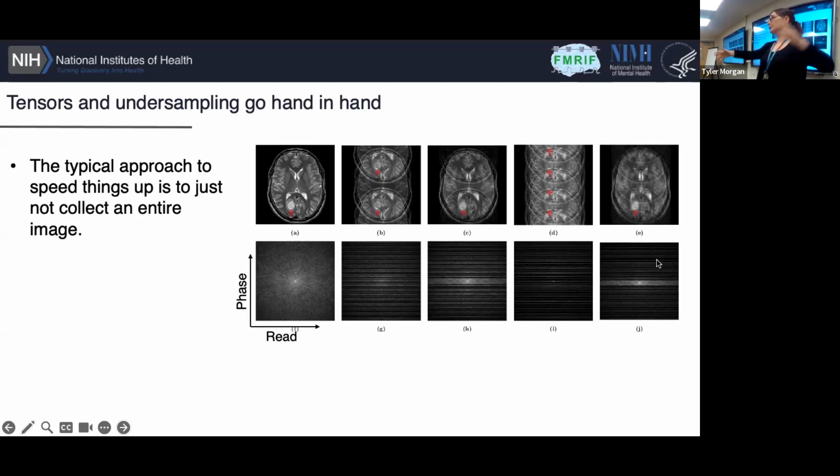So you have this huge structure you want to fill in, and you would like to just spend the next week with the person in the scanner filling in every single time point that you care about, every single echo, everything, blah, blah, blah. But we normally have to take shortcuts. One of the main ways that we take shortcuts is on things like filling in k-space. So we have to fill in the echoes and the time points faster. We have to skip some of the frequency information that gives us our spatial information. And here are a couple of different examples of what that looks like. There are different schemes and what the resulting artifacts that are associated with them are.